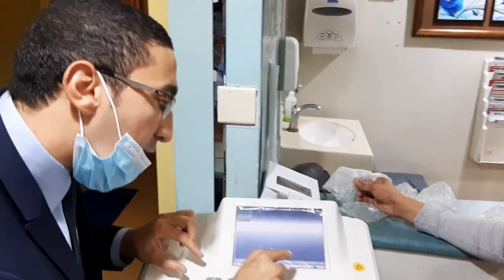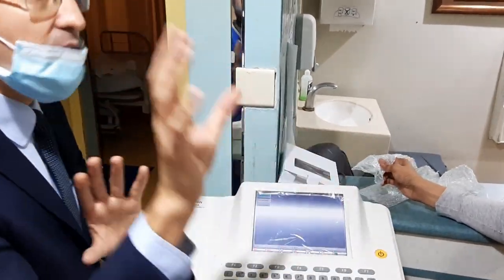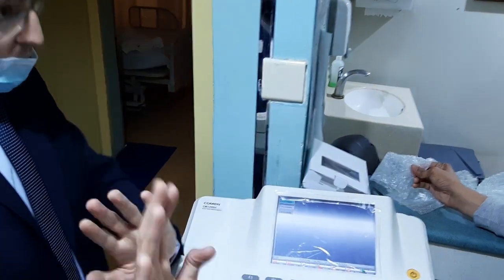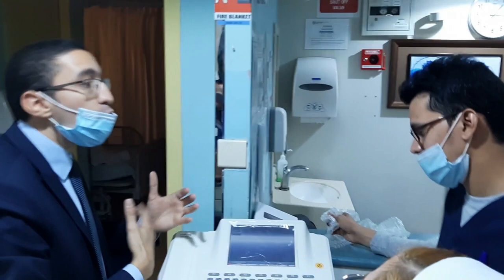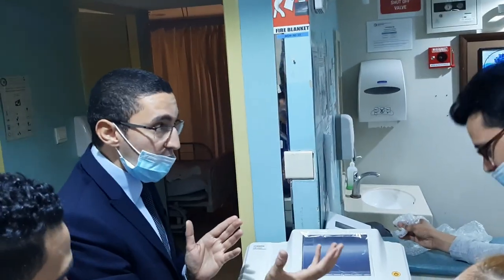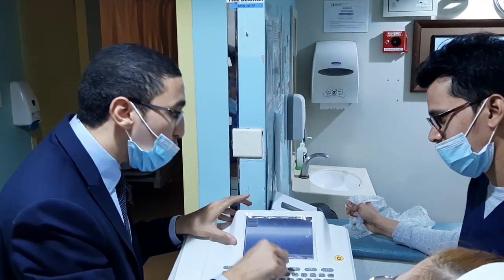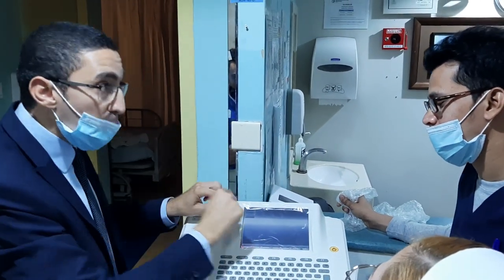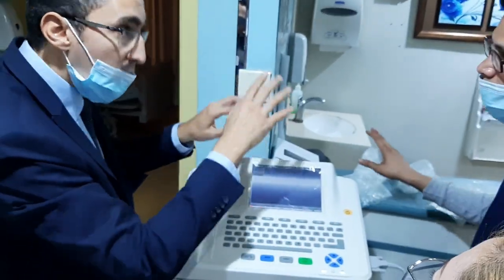And make a USB copy. You would send all this 1000, it will be saved with the computer of the engineer to be a database. So you can take again, read again, or make it again. You got it there? So if you need memory, otherwise you can delete all. Delete all, many times, so remove all. So if the coming memory is full, send it to the USB flash memory, then delete.